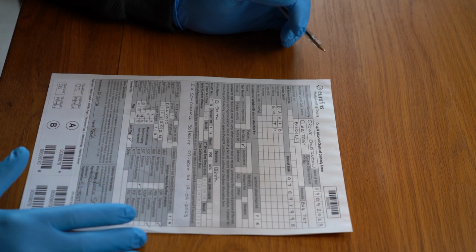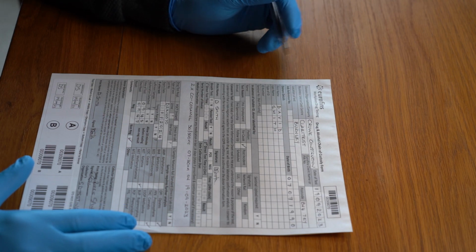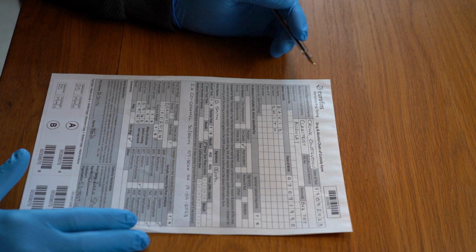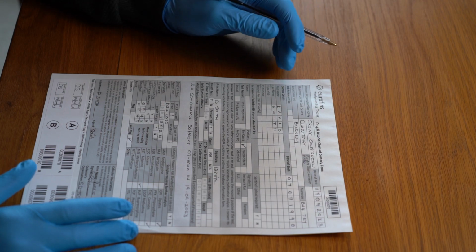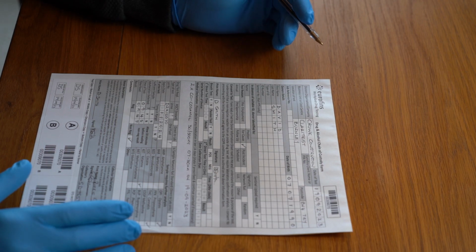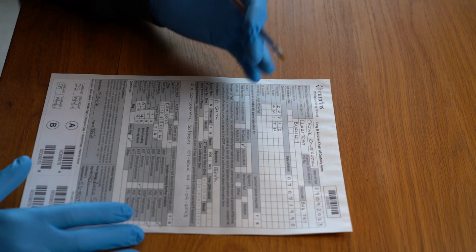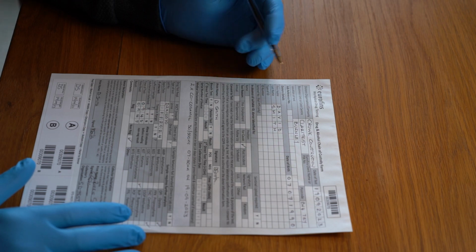In the next two videos I'm going to show you how to take samples and prepare them to send off to a laboratory for a chain of custody test for both urine and saliva. First of all, I want to go through the chain of custody test consent form, and this test that we've just done is a urine test, so I'm going to follow through the process of how to fill this out as if you'd done a urine test.